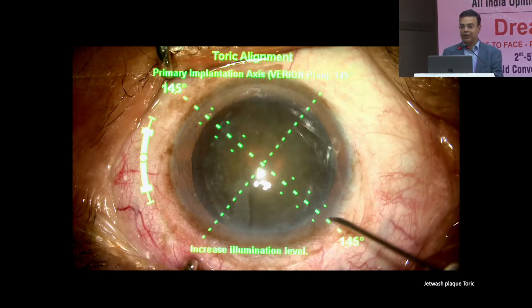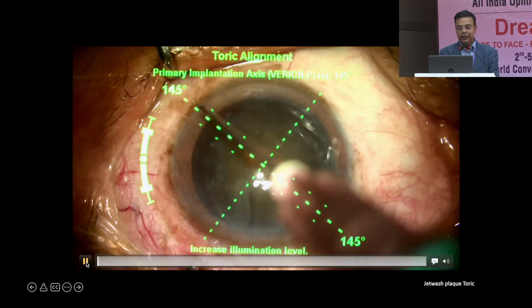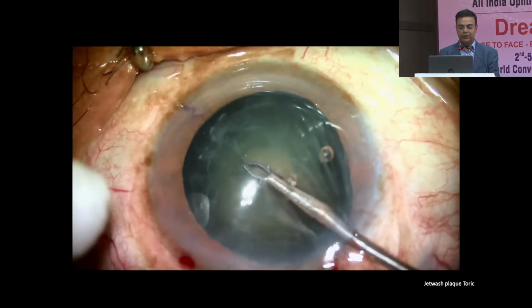This was also a vitrectomized eye following a VR surgery, and had phacodonesis and a significant, very hard cataract. So we had to plan a surgery keeping all these things in mind. He also had significant astigmatism, so we thought that if we got a chance, we'd put in a toric lens, but that was not the most important part.